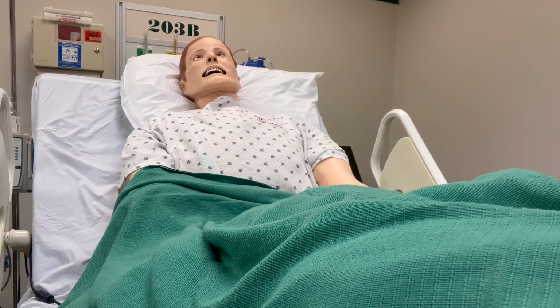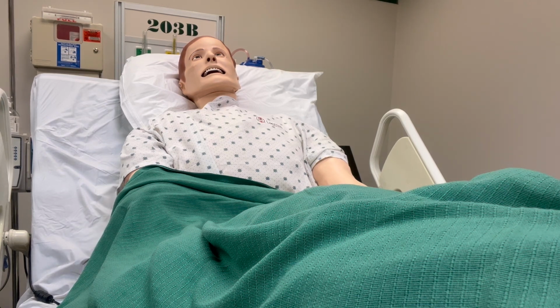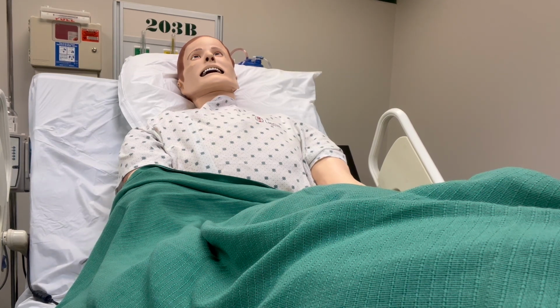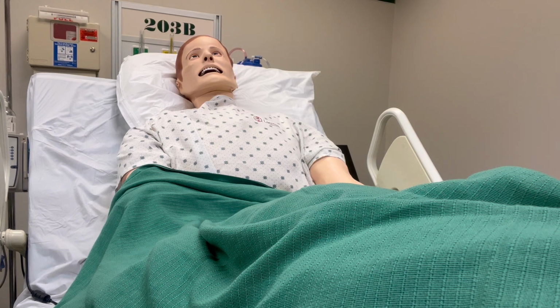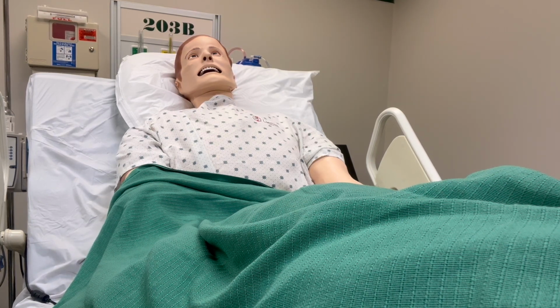So remember, we're going to check that we have the right patient, the right medication, the right dose, the right route, the right time, and the right documentation. Just meaning that we're going to document after we do this, Mr. Smith. Okay, so we're going to go ahead and just talk about needles.